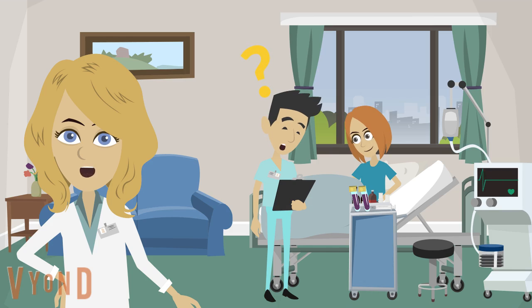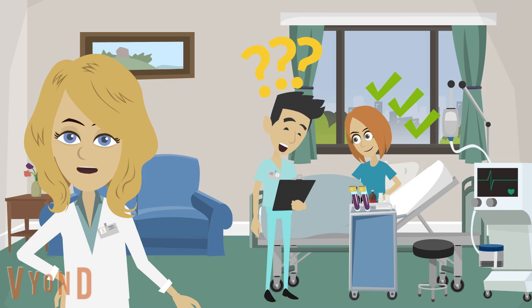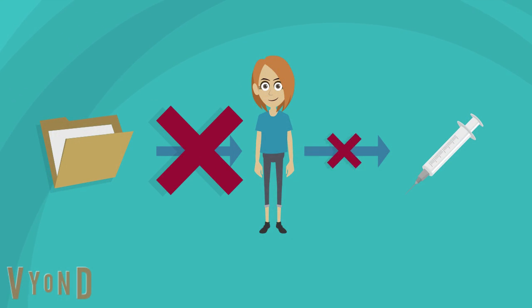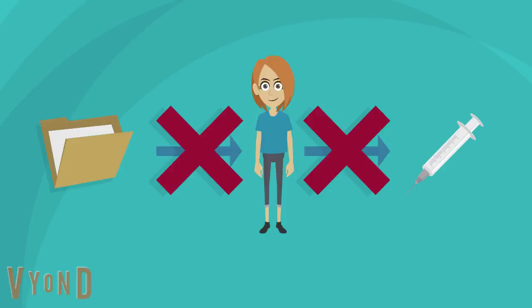To do this, the patient should be asked to state and spell their full name and date of birth against what is written on their hospital wristband and the blood draw request form. Similarly, their patient number should have been verified. If the details do not match, the blood sample should not be taken until they are rectified.